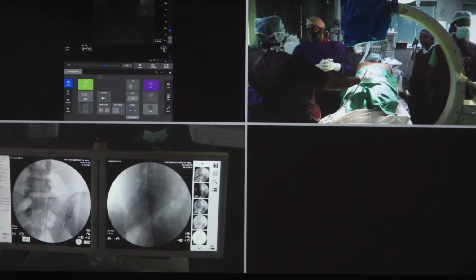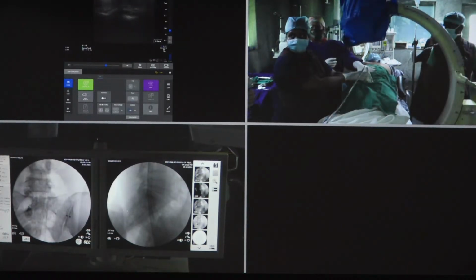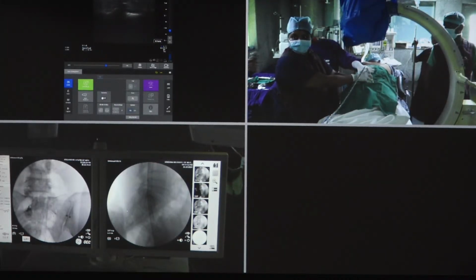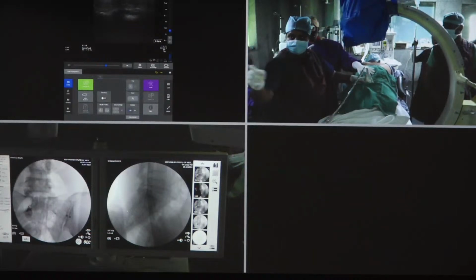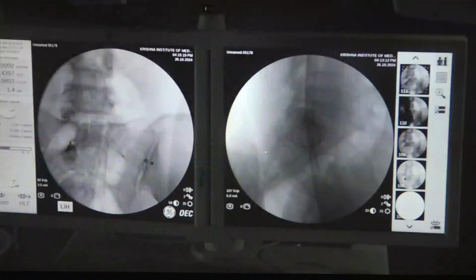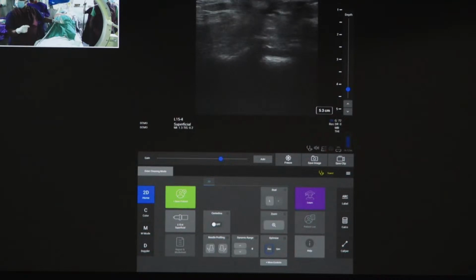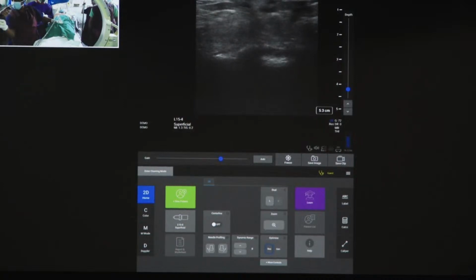In this patient, we are going to perform a caudal epidural injection. We are doing the hybrid technique, using both ultrasound and fluoroscopy guidance. Dr. Anusha is showing the ultrasound-guided part. Later I will combine it with fluoroscopy and we will perform the caudal epidural. As you can see on the ultrasound picture, the sacral cornua and the sacrococcygeal ligament. We will be turning into the longitudinal view.